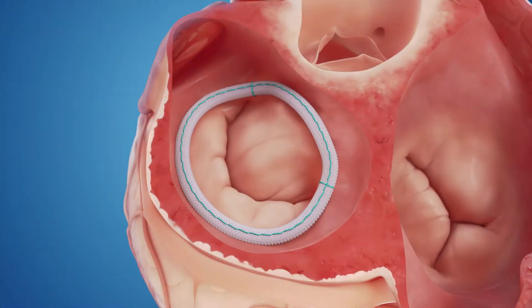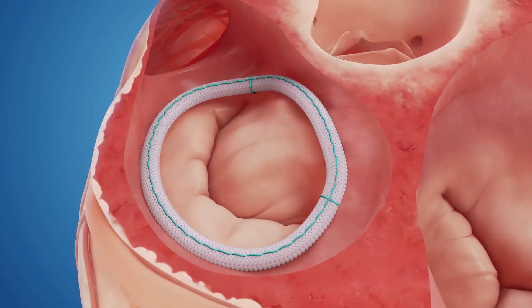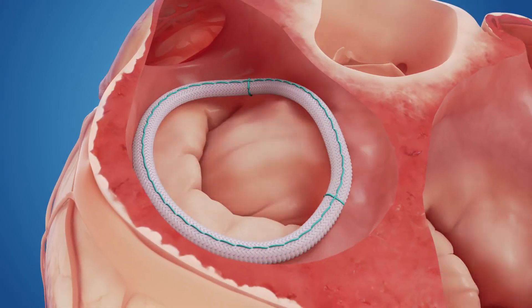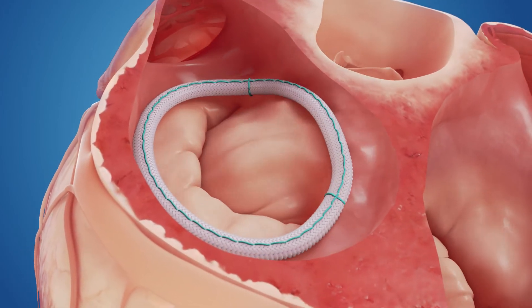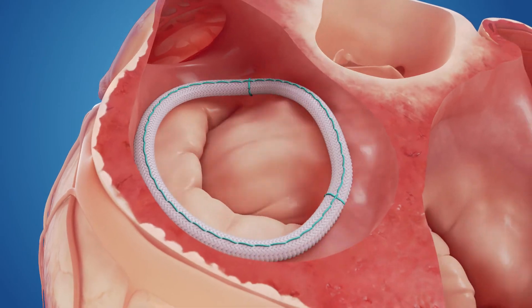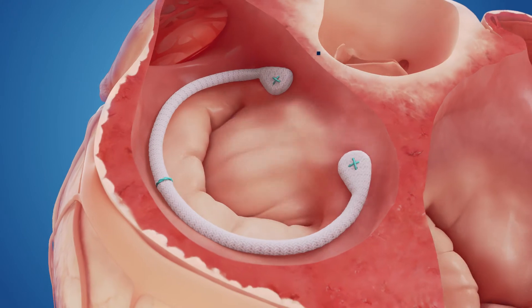Let's take a look at a repaired mitral valve. Shown here is the valve repaired with a Simuform Semi-Rigid Ring. Notice how the flexible anterior portion of the ring moves naturally with the cardiac cycle, from a saddle in systole to a planar shape in diastole.